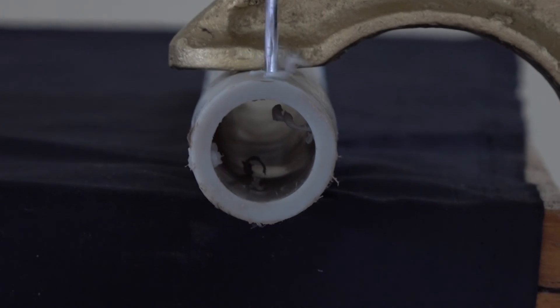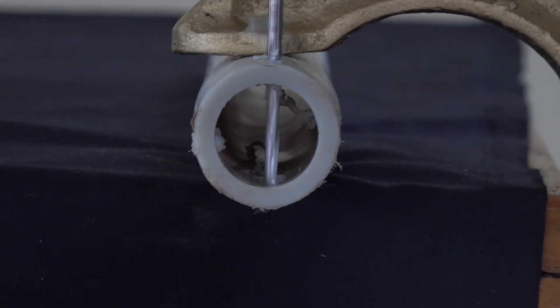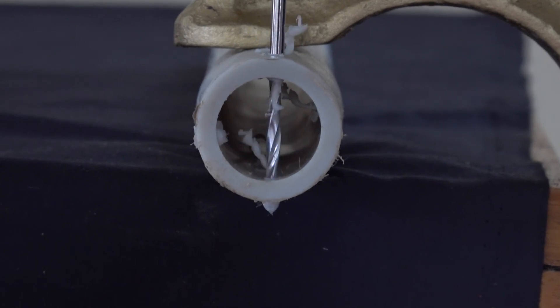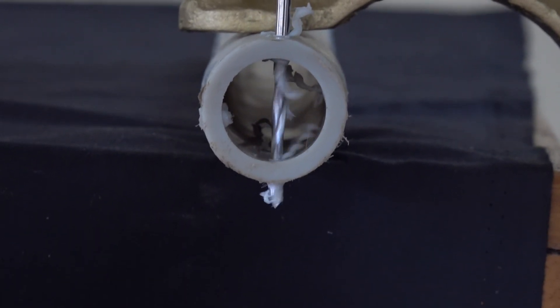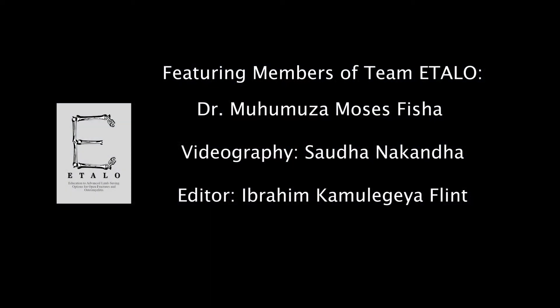Here you see an example of good controlled drilling, where we go through the near and far cortex. Once out of that far cortex, do not go very far and maintain a very controlled manner. There is no plunge and no injury to any structures.